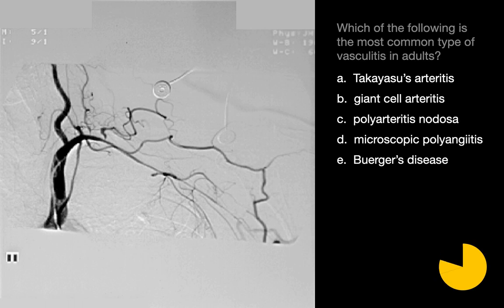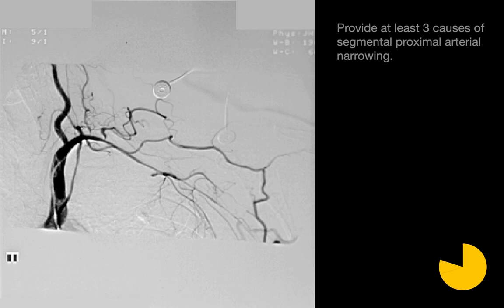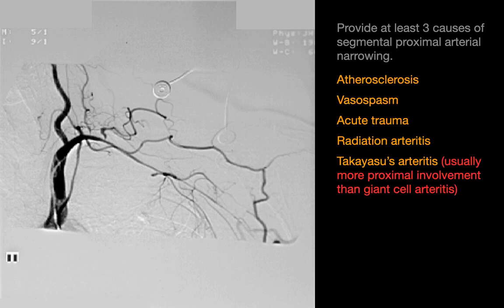The most common type of vasculitis in adults is giant cell arteritis, which is the diagnosis in this particular case. Causes of segmental proximal arterial narrowing may include atherosclerosis, vasospasm, acute trauma, radiation arteritis, and Takayasu's, which usually has a slightly more proximal involvement than seen with giant cell arteritis.